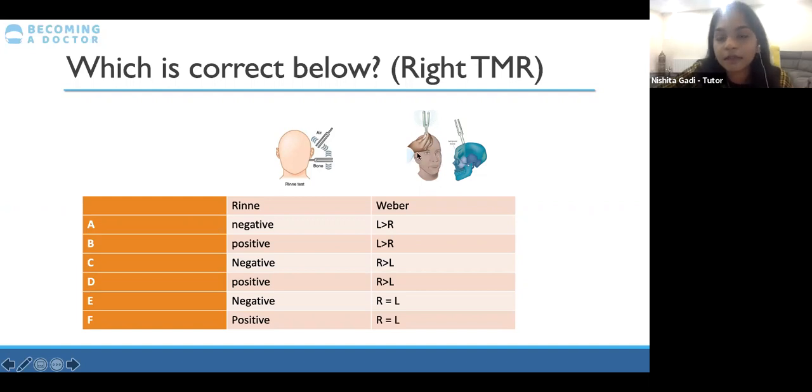Weber's test is testing conductive hearing loss, and in that bad ear you don't have air conduction, so the bone conduction sounds so much louder. So it won't be the first two answers, because that's suggesting left is better than right, but actually right will be better than left. And it won't be equal either. Right will be better than left. We're assuming that the other ear is normal.